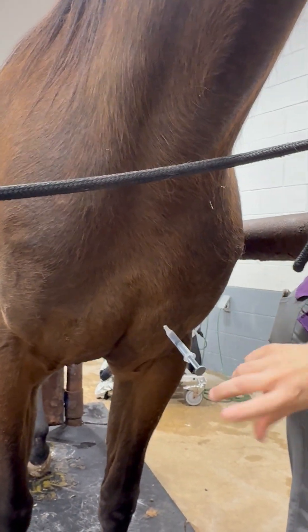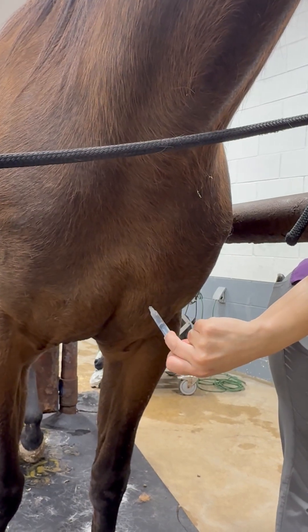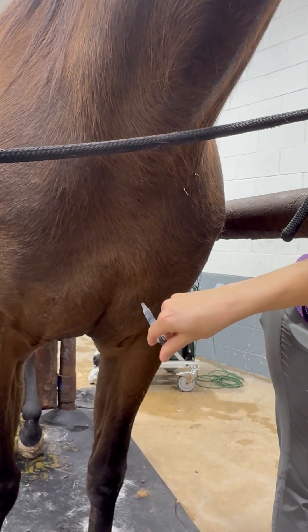I tend to pat, pat, pat to get the horse ready — be prepared because sometimes they will want to bite you because they think you're a fly. Pat, pat, pat, and then stab. I kind of let go so if they shift, it doesn't come out. Again, draw back, make sure there's no blood, and then give.